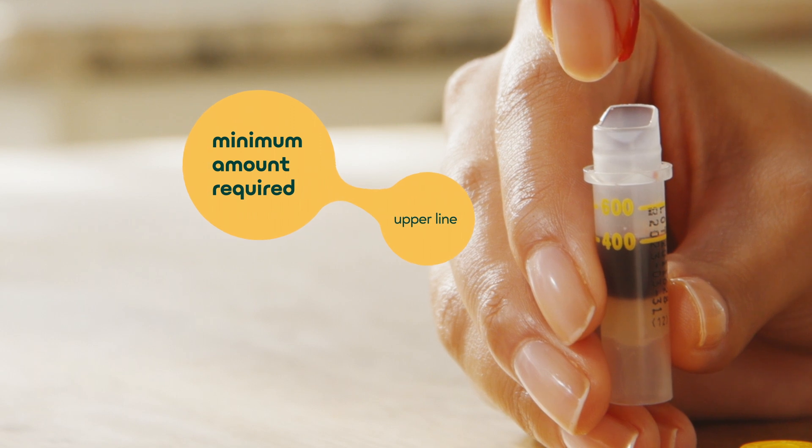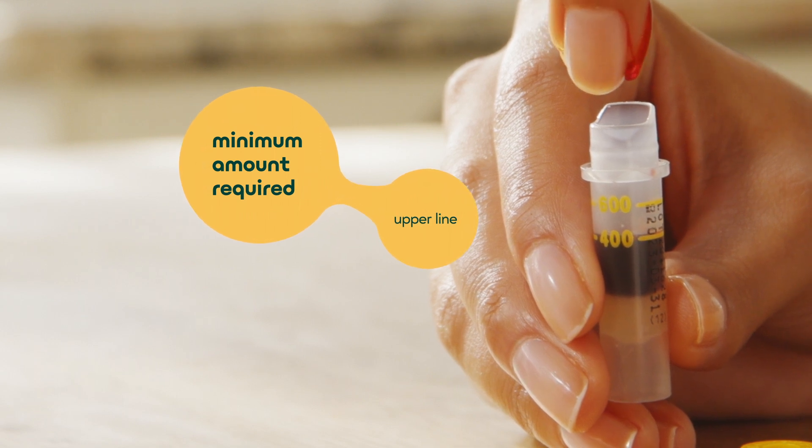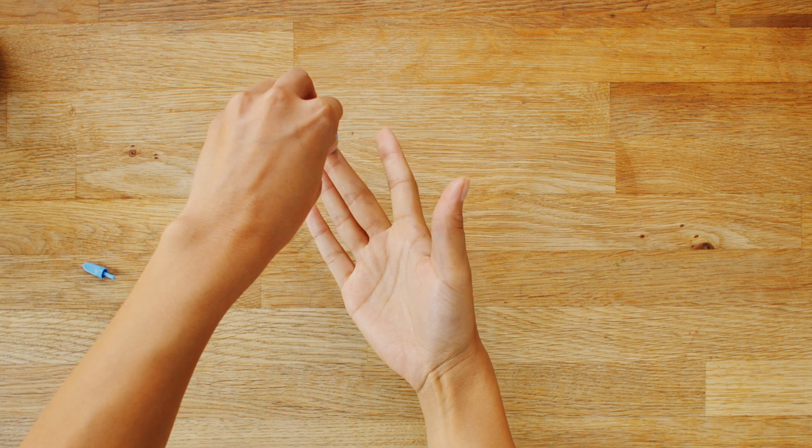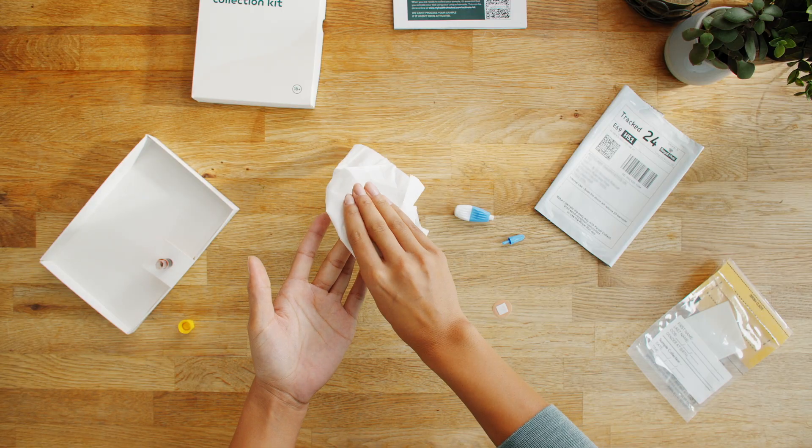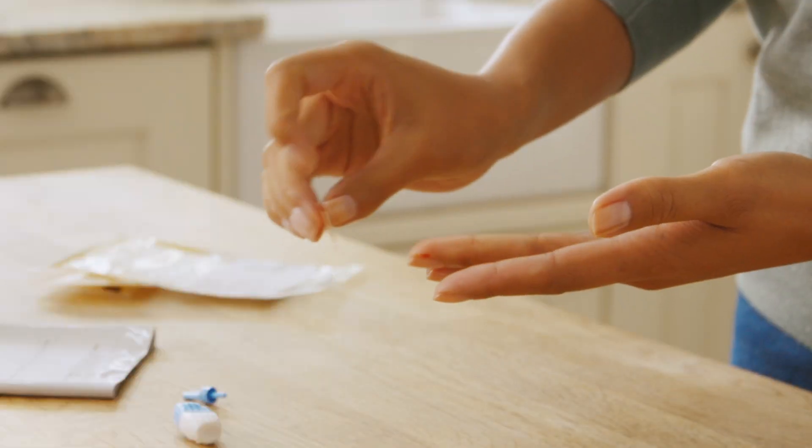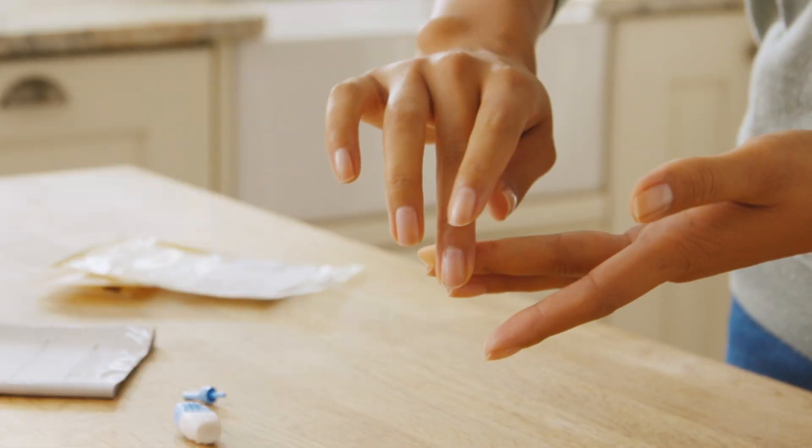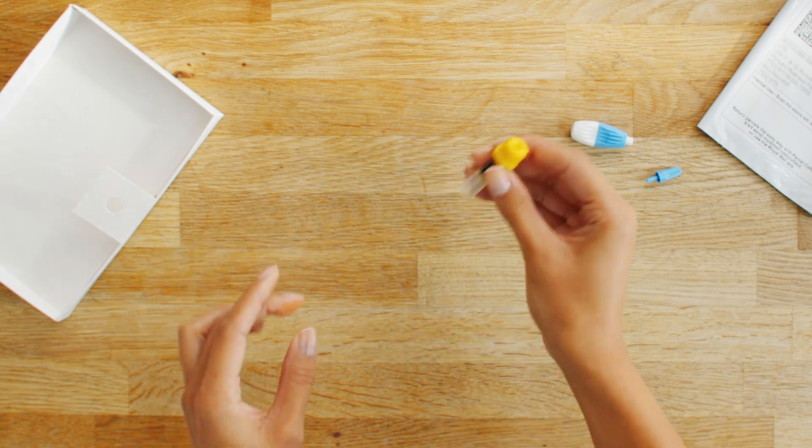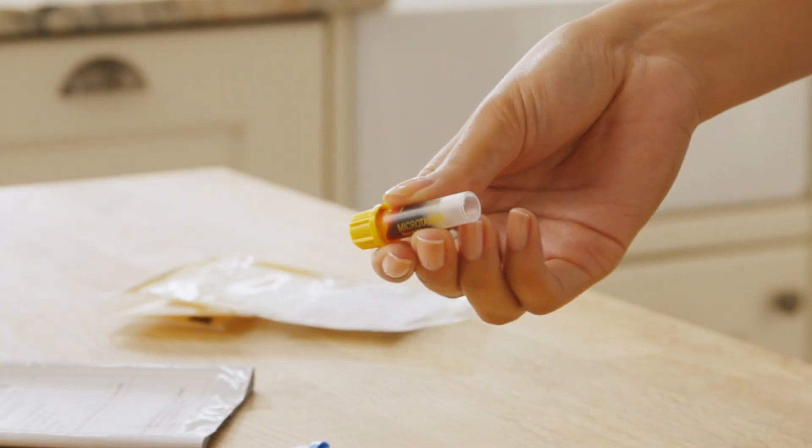A minimum amount of 0.6 millilitres is required. If you require more blood, you can use a spare lancet on a new finger to reach the required amount. Clean your finger, let it dry, and apply the supplied plaster to stop the bleeding. Place the cap back on the tube. You should hear a click, then turn it upside down at least 10 times.